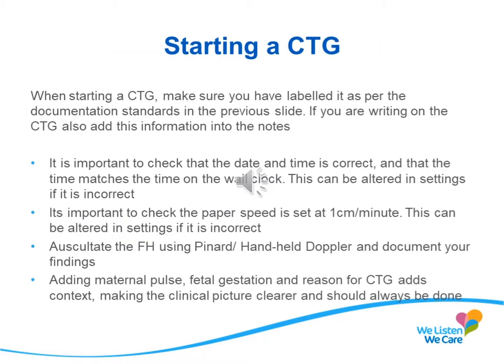When you start a CTG, make sure that you've labelled it as per the documentation standards outlined in the previous slide. Add the information that you've written to the CTG into the mother's clinical notes. It's really important that when you start the CTG that you check that the date and time on the machine is correct and that this matches the time on the wall clock in the labour room.